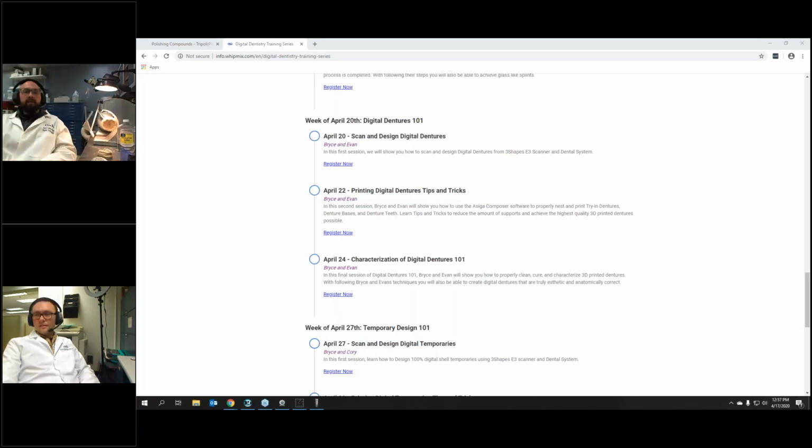Yep. We had another question from Trish. Do you rinse the splint after you apply the mineral oil? You can. I applied it a little bit heavy. If I was to go back, I would apply a little less of the mineral oil, or if I had a proper application tip. You can rinse it, but it will rinse away the mineral oil a little bit as well. Usually I'll use compressed air and blow it out, like so.